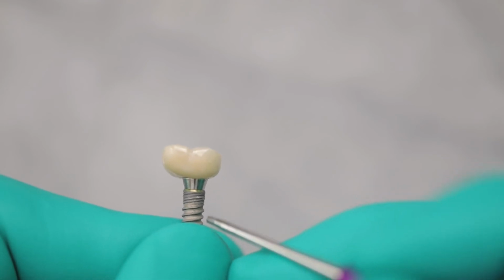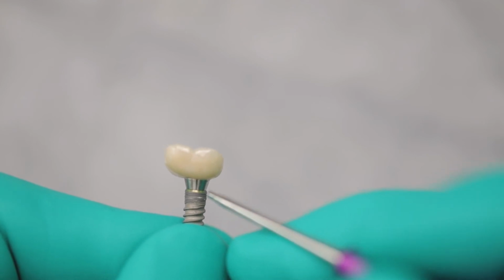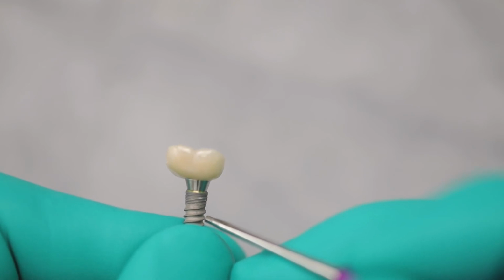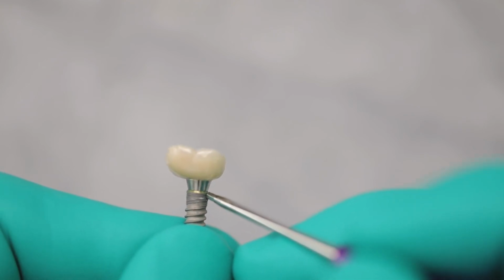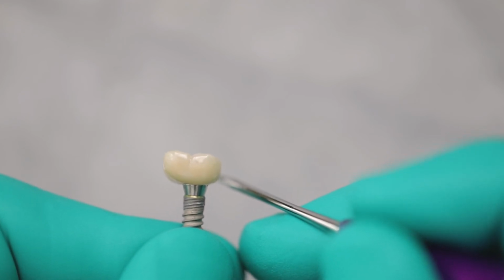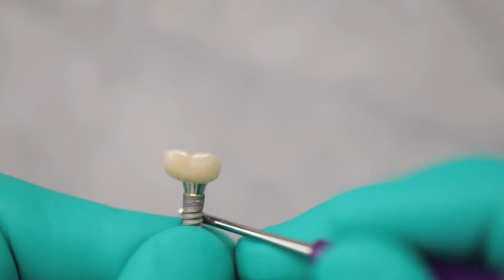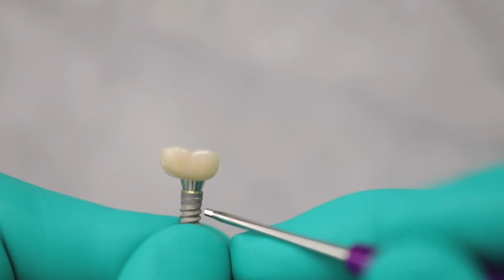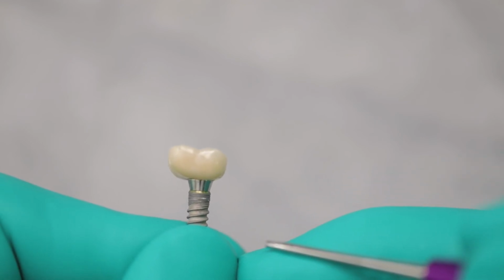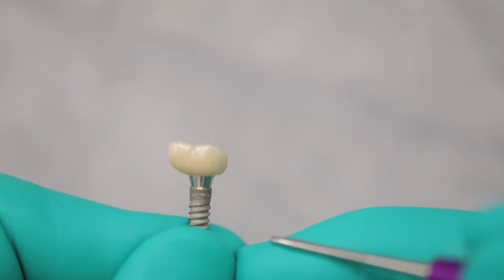Either the doctor didn't have any bone to work with and they went with a small implant to get it in, or 2, they just simply don't know any better and they had plenty of bone and they just put a small implant in this location. Either way, this implant being fairly small underneath a molar position like this is a danger. It's a risk factor. It's too much load for this small implant, and you can run into mechanical complications. And if those mechanical complications turn into biological complications, you have an implant that makes for a very nice story here on the table, right? And we don't want that in our practice.